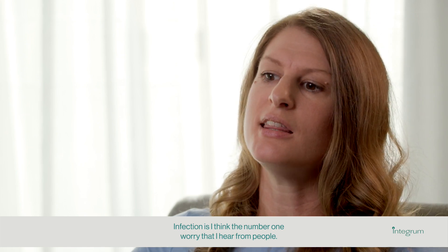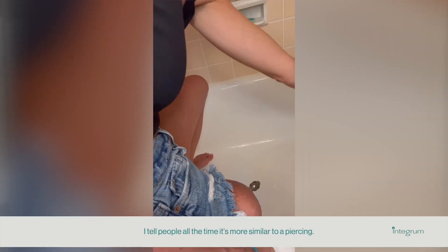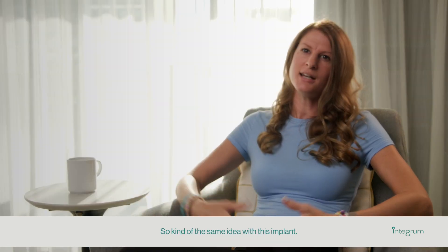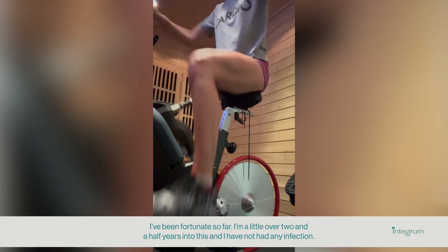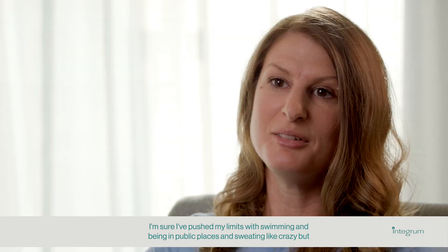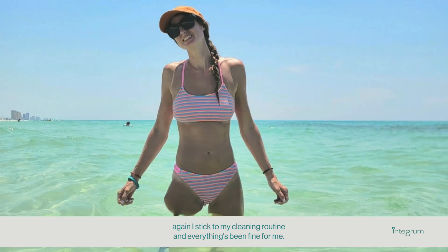Infection is the number one worry that I hear from people. I just keep my aperture site clean — I clean it twice a day. I tell people all the time it's more similar to a piercing: you want to keep a piercing clean to keep it from getting infected, and it's kind of the same idea with this implant. I'm a little over two and a half years into this and I have not had any infection. I'm sure I've pushed my limits with swimming, being in public places, and sweating like crazy — but I stick to my cleaning routine and everything's been fine.